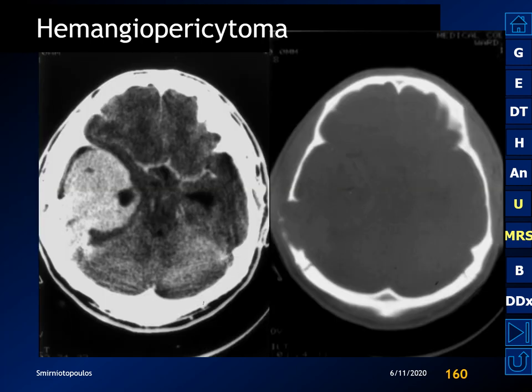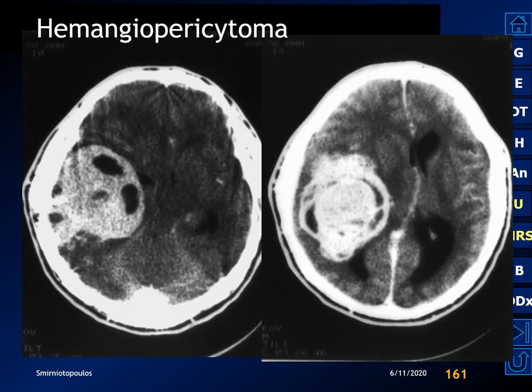Here's another example of a hemangiopericytoma on CT. It is a heterogeneous lesion associated with bone destruction and has a narrow base of attachment. Because the base of attachment is so narrow, it actually appears to be an intraaxial mass surrounded by brain.